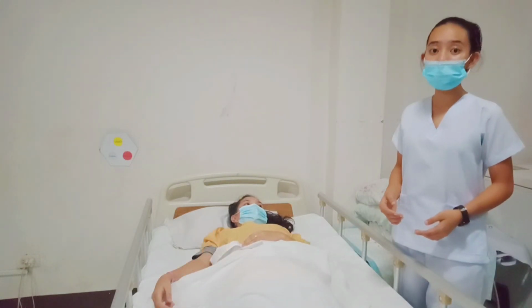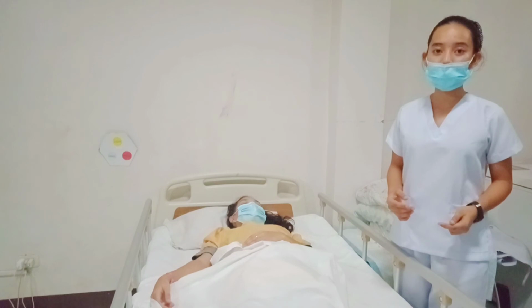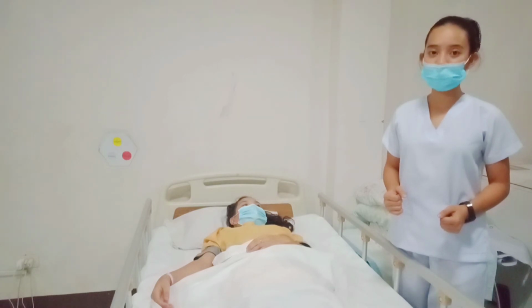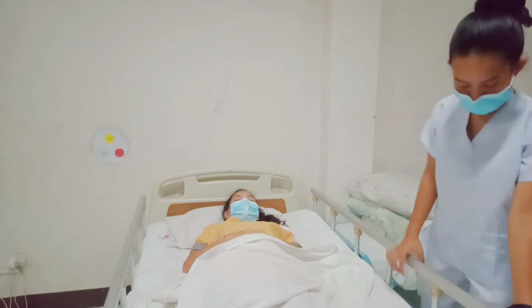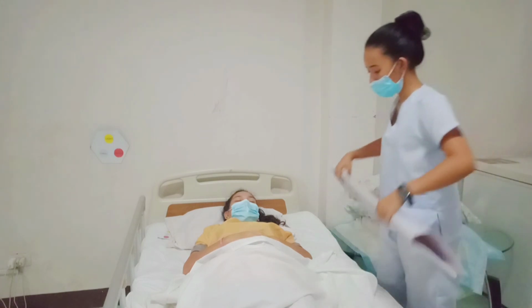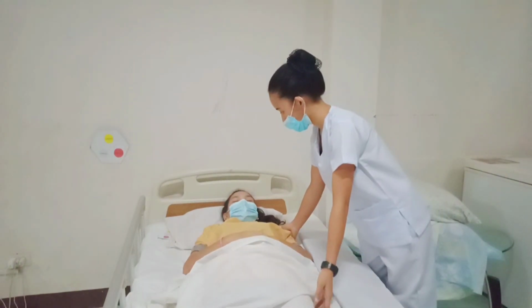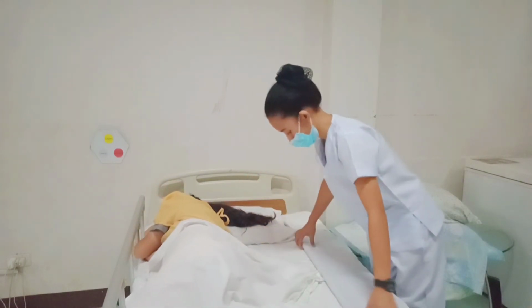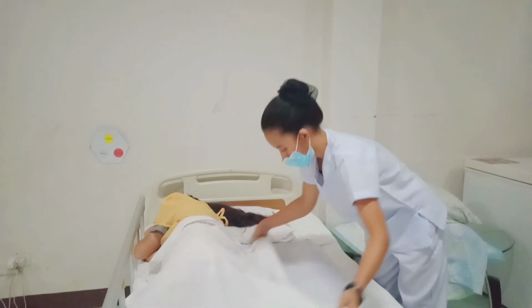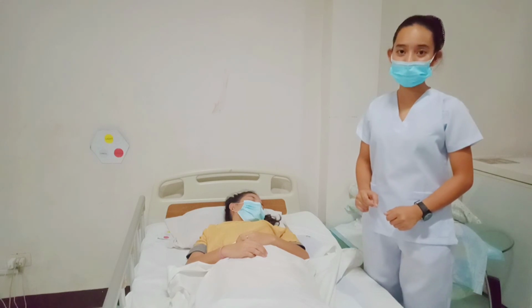Position yourself and the client appropriately before performing the move. And then move the client closer to the side of the bed, opposite to the side the client will face when turned. And then use a pull sheet beneath the client's trunk and thighs to pull the client to the side of the bed. But first, let's lower the side rail. Roll up the sheet as close as possible to the client's body. And then pull the client to the side of the bed.